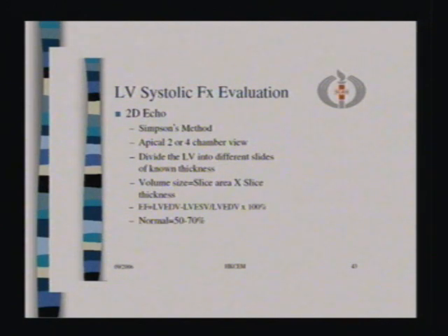Of course, our echo machines now calculate it once you feed in the diastolic and systolic volumes, and you normally don't need to calculate it yourself.